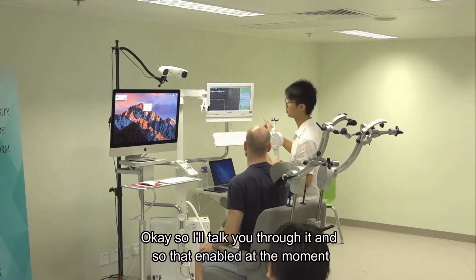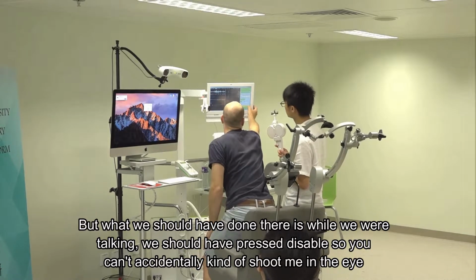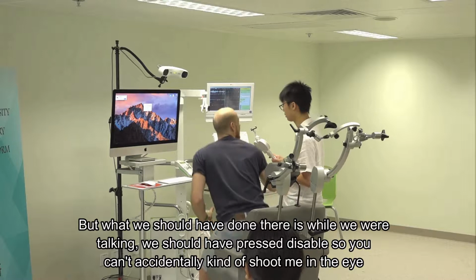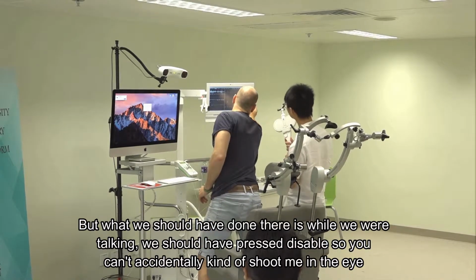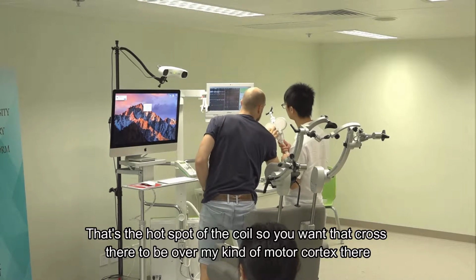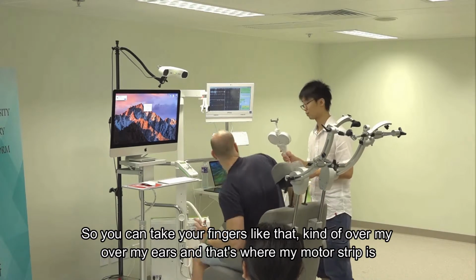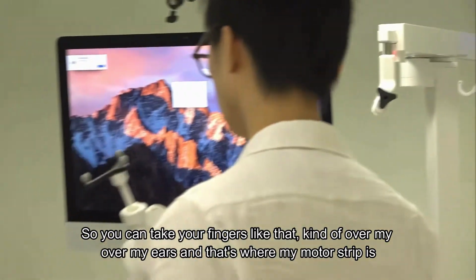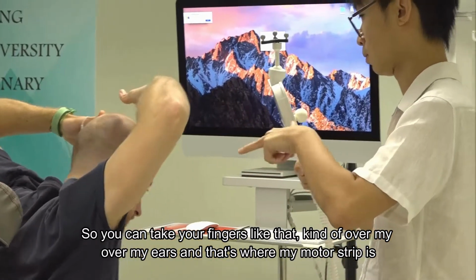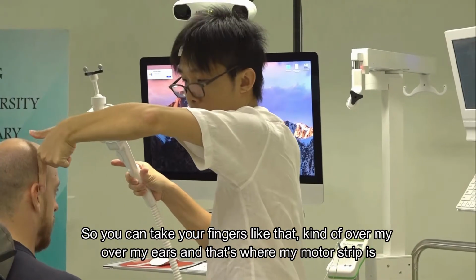So that's enabled at the moment, but what we should have done there is while we were talking, we should have pressed disable so you can't accidentally shoot me in the eye or anything. Right. Okay, so enable there, and then that crosshair there, that's the hot spot of the coil. So you want that crosshair to be over my motor cortex there. So you can take your fingers like that, over my ears, and that's where my motor strip is.